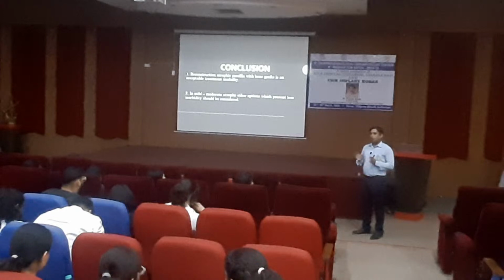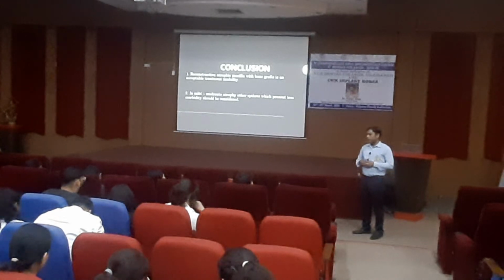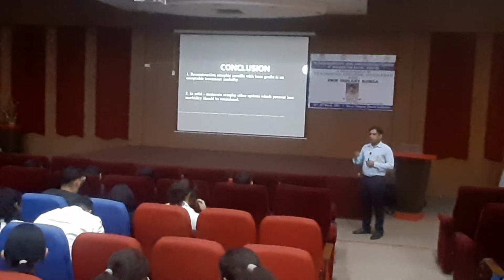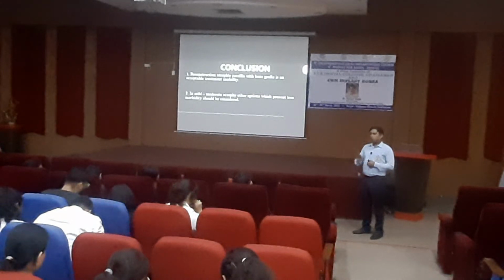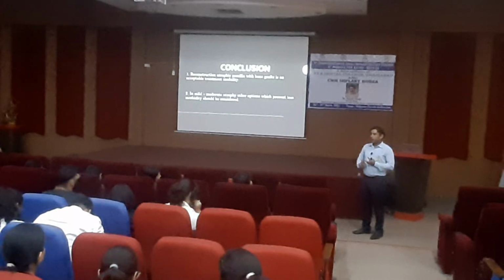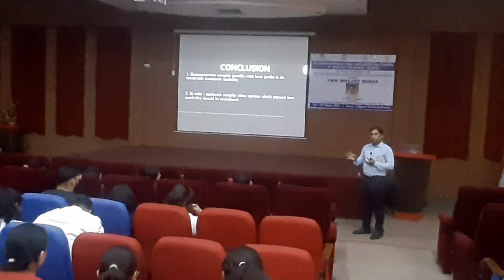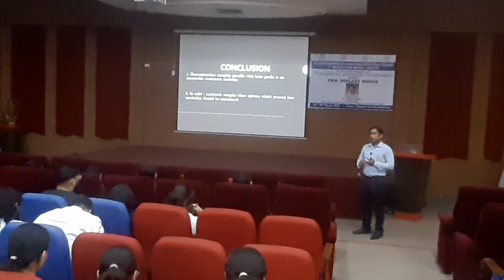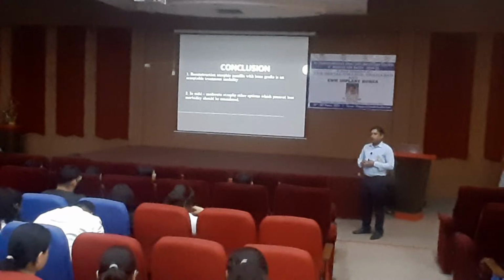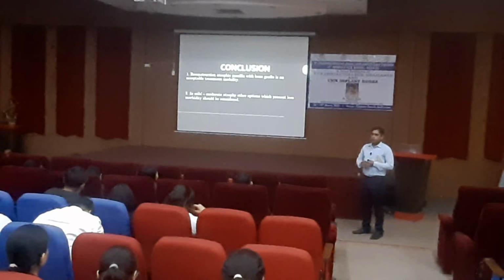अगर ग्राफ्टिंग में हार्वेस्टिंग करने में प्रॉब्लम है, then you start using a different type of graft material like allograft, xenograft. It is easily available now. So put a graft, put over the membrane and suture it. So your expertise basically in two things. One is the implant placement should be good according to the bone, quality of the bone, and second is the soft tissue handling. How you suture it back, how you close it back, how you create a soft tissue, how you advance it. These things you should know.